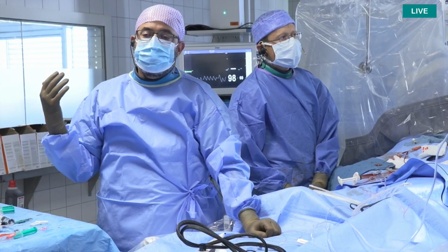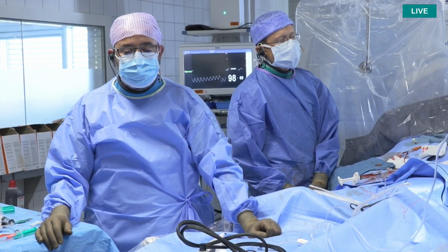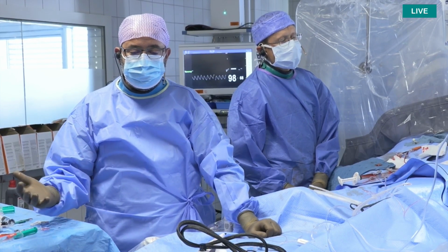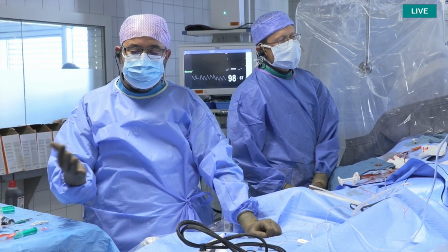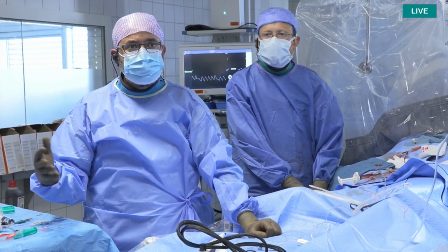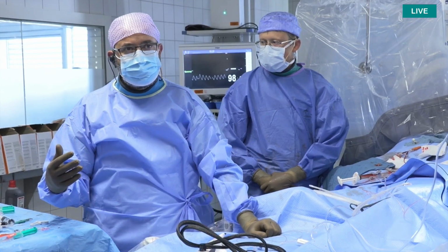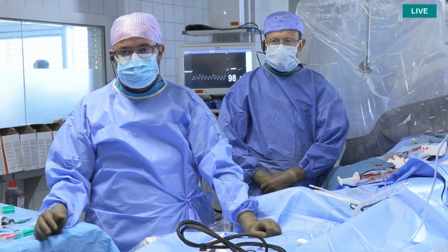Probably you will know that you will need to do something if there are significant lesions. Then you need to prepare them with one or different tools. But you will not be able to decide how much calcium this is, and whether this calcium is going to dictate an atherectomy-based technique or a balloon-based technique or something else. There are newer CT generations that may be able to improve assessment of calcium, but we don't have them in our practice, and I think the majority of centers don't have these very modern CT machines yet.